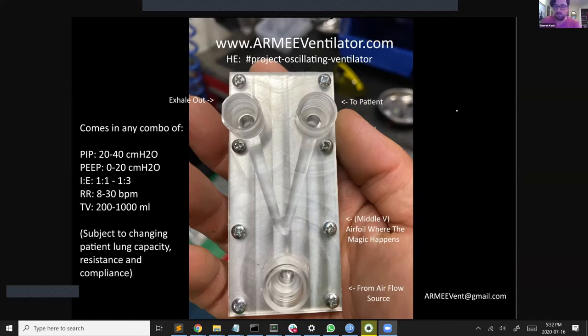Air comes in the bottom at a low flow rate, which is then turned into a high pressure flow, which flows to the patient on the right side, where it fills up the patient's lungs up to a specified pressure that is set by the geometry of the device. Once that pressure is released, it goes down to the V airfoil, where it will then exhale out the exhalation port. Then the pressure in the lungs decreases down to a set pressure, at which point the process will repeat itself, and the air will flow back to the patient's lungs.